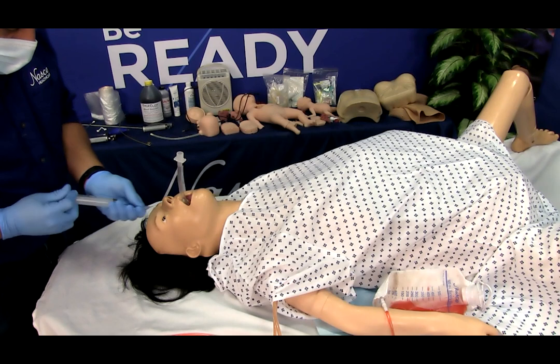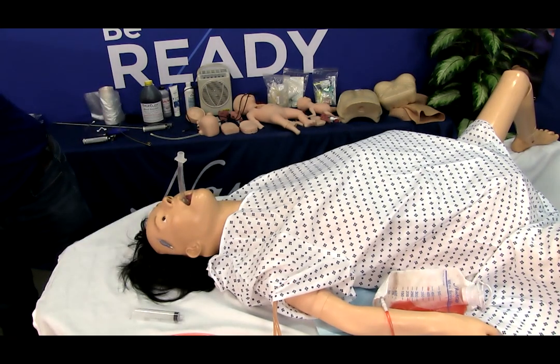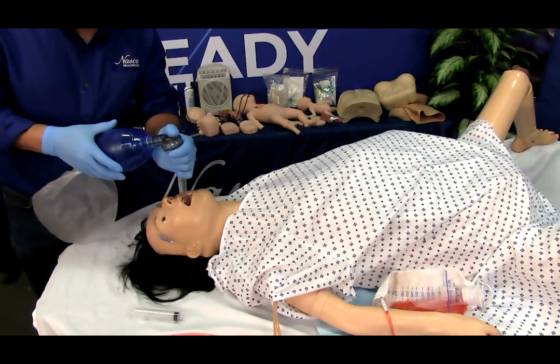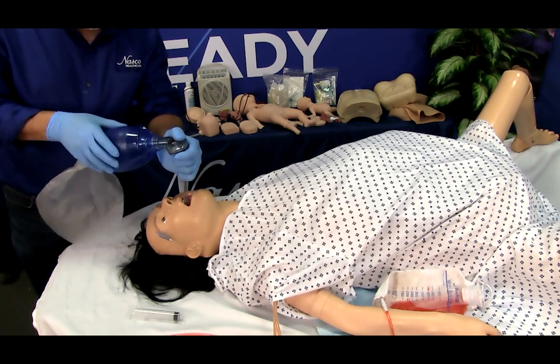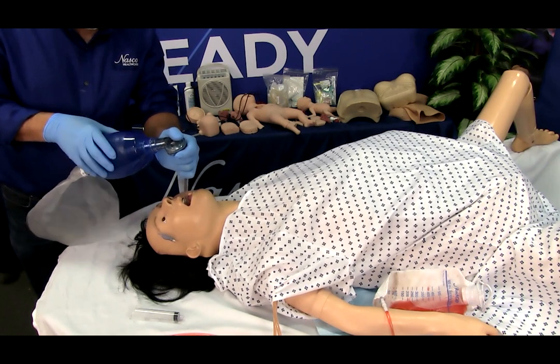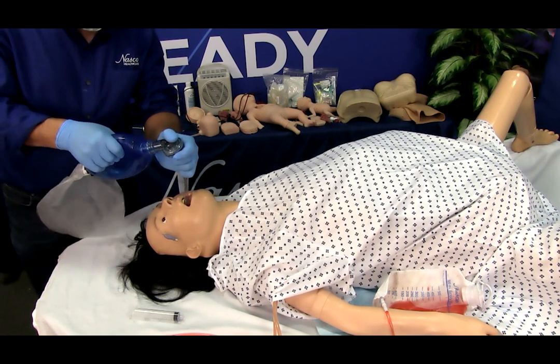Visualize chest rise and fall with ventilation. Please ensure the cuff is properly deflated before removing the appliance, or you may cause damage to the airway.